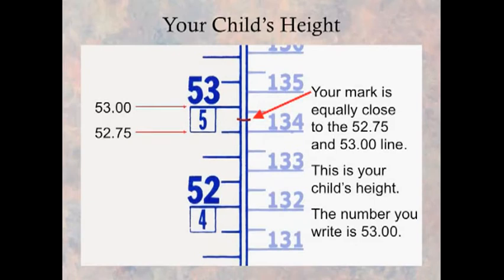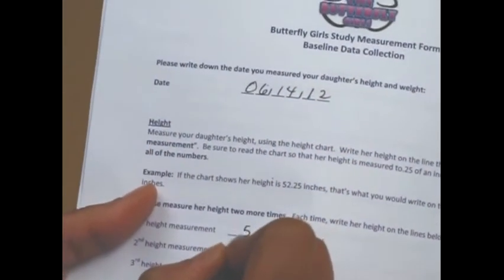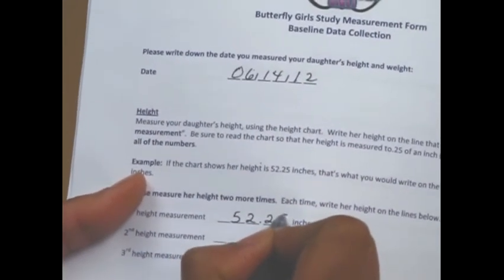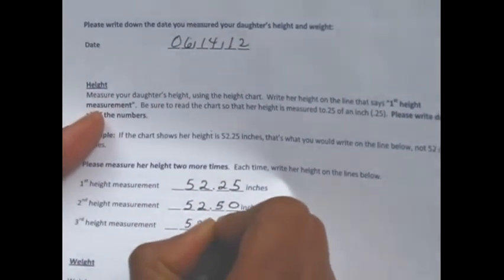As in this example, you would write 53.00 on the form. This is your child's first height measurement. Write that number on the first line of the measurement form. Repeat each step 2 more times and write their second and third height measurements on the form.